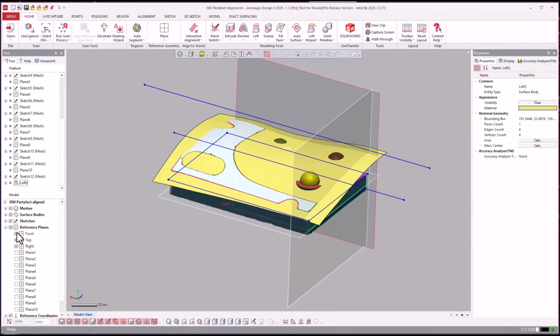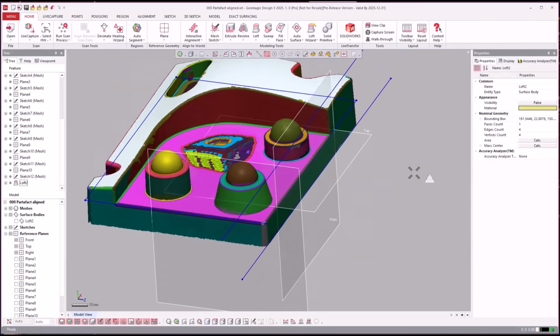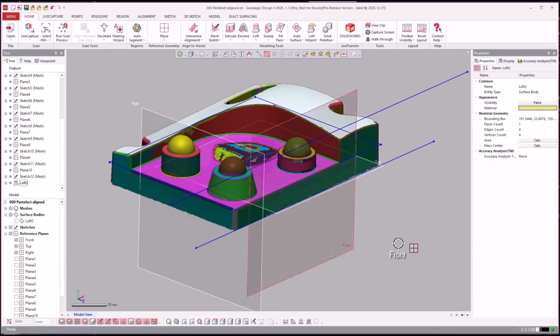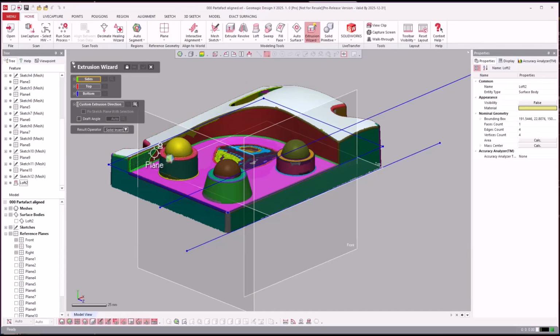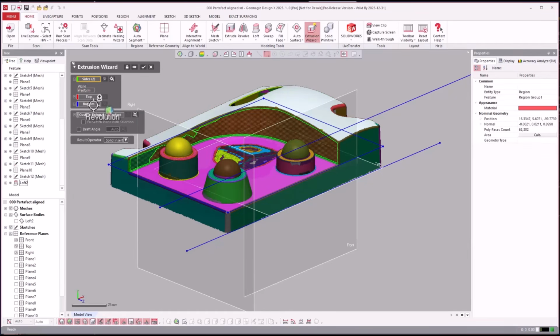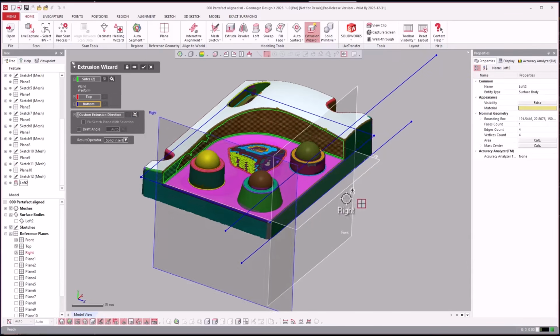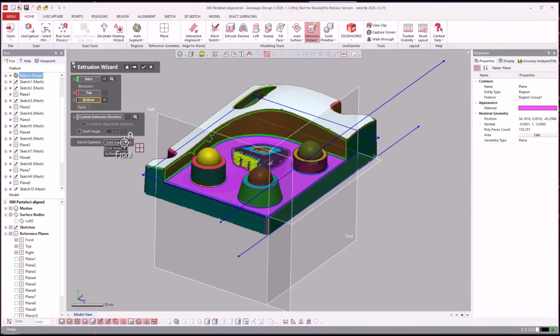And some people, you may be asking yourself, Greg, why are you doing this way? I'm just kind of laying this out for you. On complicated parts, I have customers that do it this way. This is a compatible workflow that people use every day. So that's really what I'm pointing out here, is that I can say, hey, let's do this as a solid cut. Solid insert cut. So for right now, we'll just do it as a solid insert.